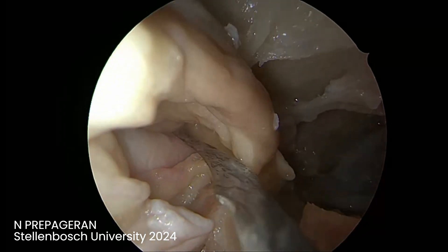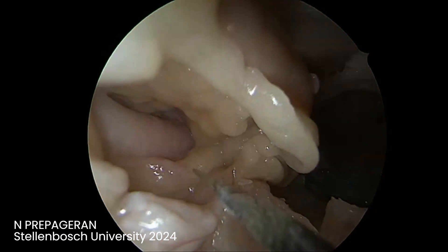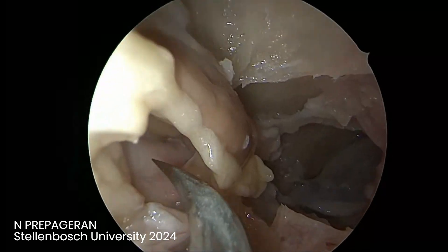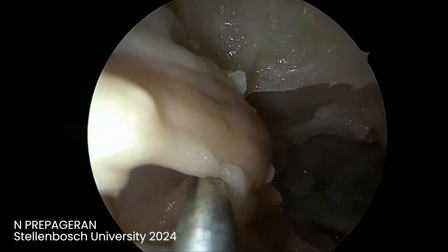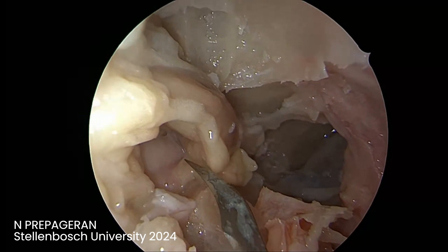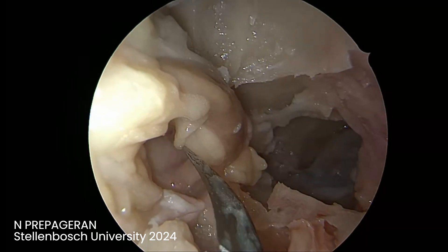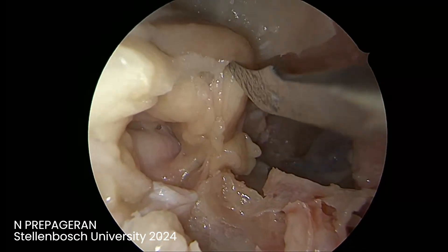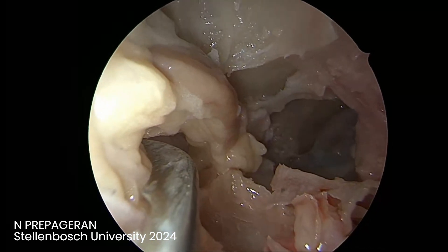Now you can see the optic nerve decompressed 270 degrees — that's the orbital apex. We only remove tumors here. Usually when you remove and decompress the orbit, you take away the fat. Retract the medial rectus upward between the medial rectus and the inferior rectus. Your tumor is here — your tumor actually protects the optic nerve.